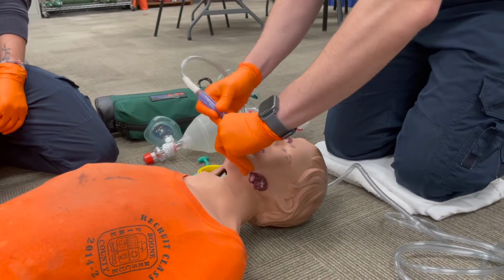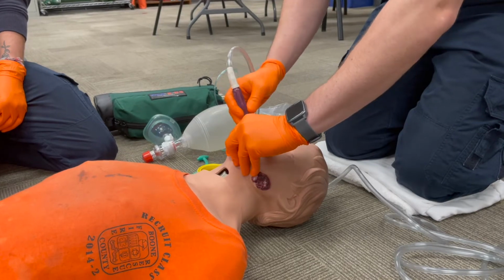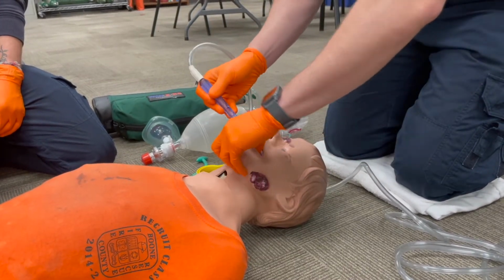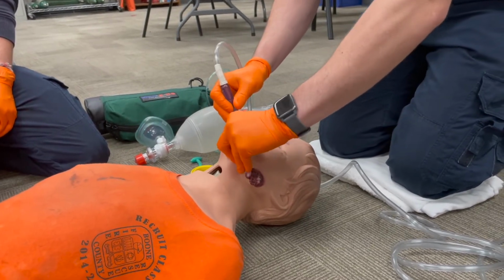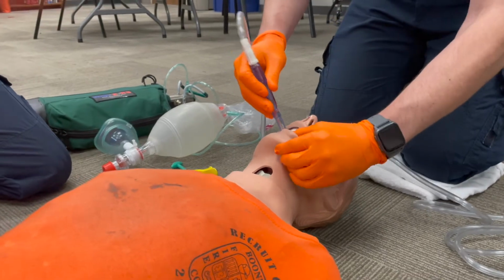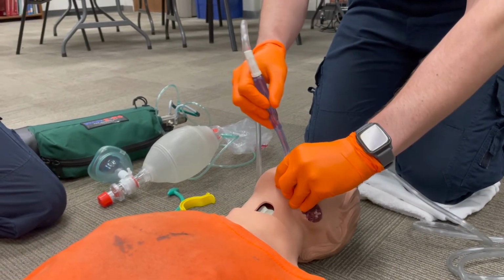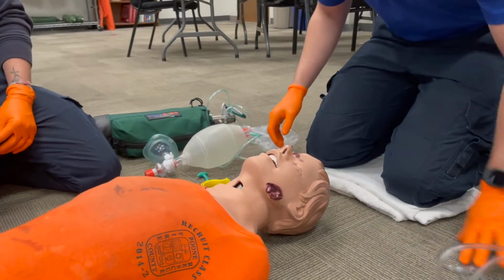until everything that is in there, if there is anything in there, is not in there anymore, because it doesn't make any sense to ventilate the patient with a BVM if there is stuff in the oral cavity or the airway, because you're just going to force that down into their lungs. So oftentimes you can just grab their jaw and then use your suction catheter and suction the oral cavity until you've cleared that of whatever there is in there.